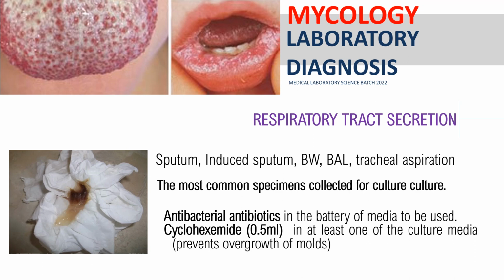Pero the way that you will collect the sample, for example sputum, syempre dadaan siya sa upper respiratory tract mo. Kung dadaan siya dun, madadaanan din yung mga normal flora. And then, that bacteria can actually hinder identification. Kaya ang gagawin natin, we need to add antibiotics para yung ma-isolate lang talaga natin, class, is fungi.